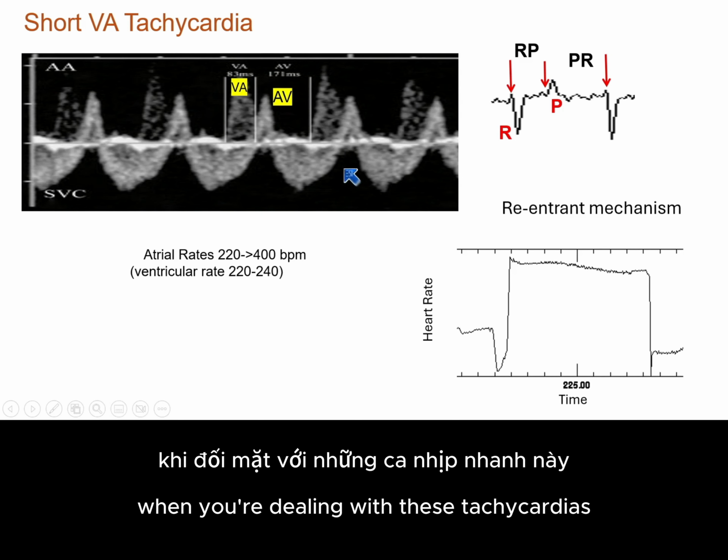So this is a picture of simultaneous superior vena cava and aortic arch spectral Doppler. So we have our SVC below baseline, and remember, what we're measuring when we measure atrial contraction is the reverse flow, because that's when the atrium contracts. So this actually is the A wave here, and this is going to be the V wave. When you use this technique, you should always look for two waves going in the same direction, because again, the A wave is going to be retrograde, so it's going to be going in the opposite direction of the filling part of the wave.